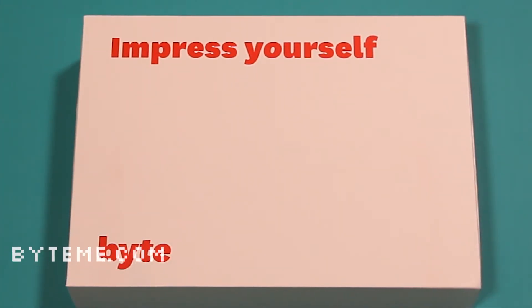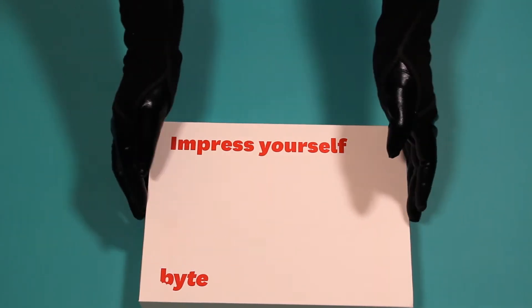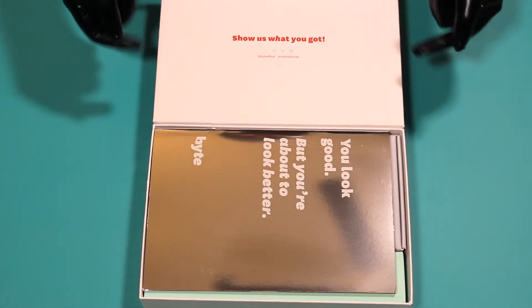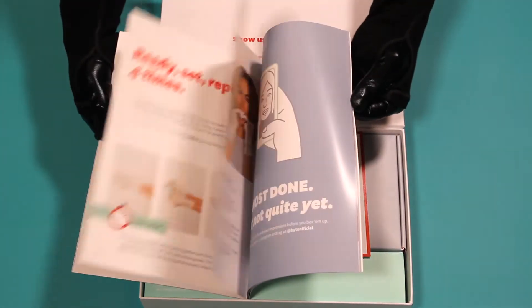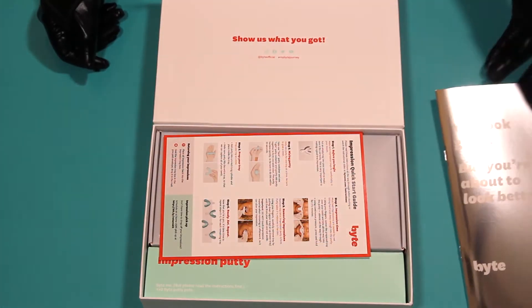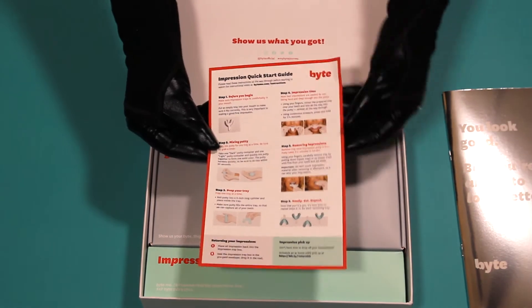The Impressions Kit is the first step to getting aligners with Byte so they can look at your teeth. The first item in the kit is a nice silver booklet that's basically a guide to all the steps with Byte. Here's the Quick Start Guide for the Impressions Kit.